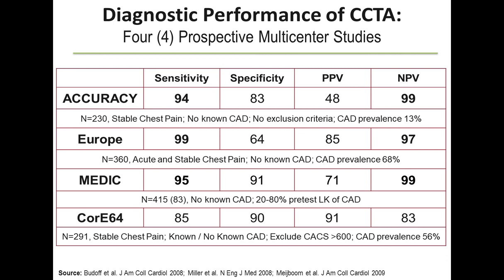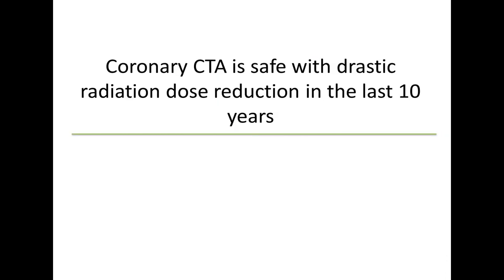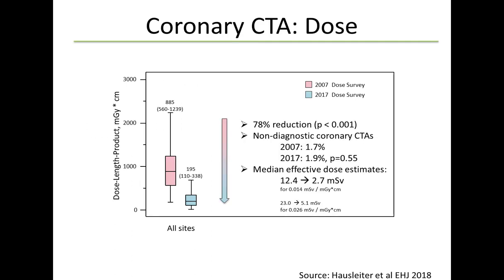Now, many people will say, well, CT is a powerful tool, but can it really be safely applied across the patients that we're evaluating for possible but not yet confirmed coronary disease owing to the concerns regarding radiation? And while radiation dose always needs to be top of mind, I would posit to you that the evidence to date would suggest that CTA is a safe test when used appropriately. Here I highlight work from Jörg Hausleiter from the PROTECTION VI database, which he presented at the European Society of Cardiology in Munich back in 2018 and published in the European Heart Journal.